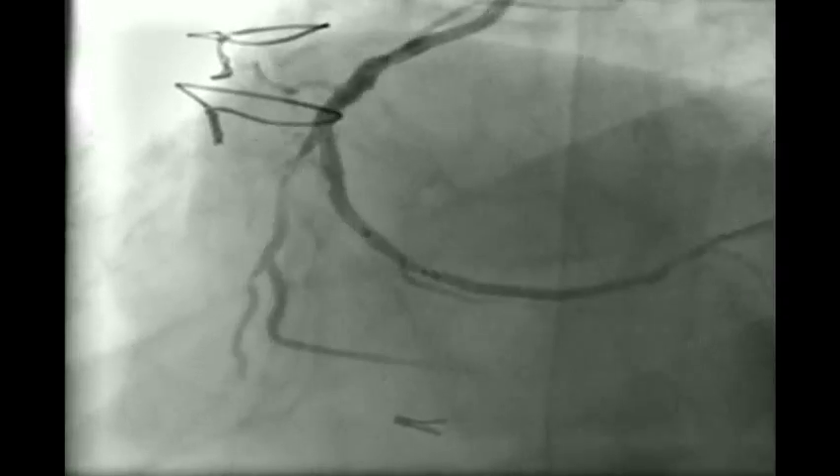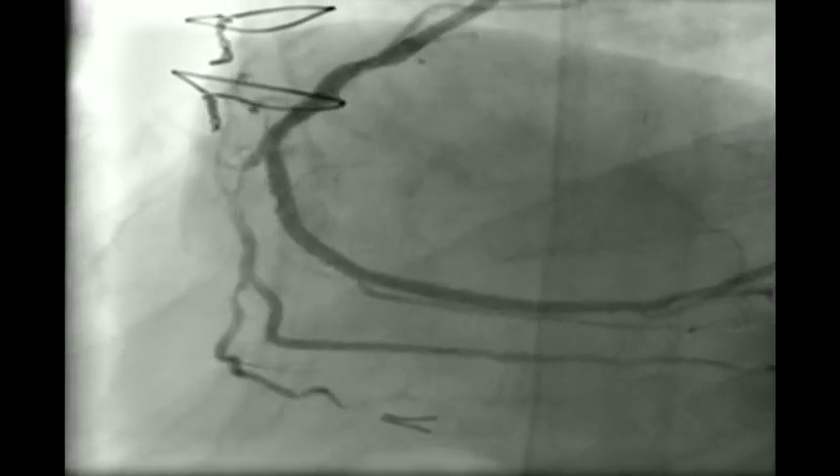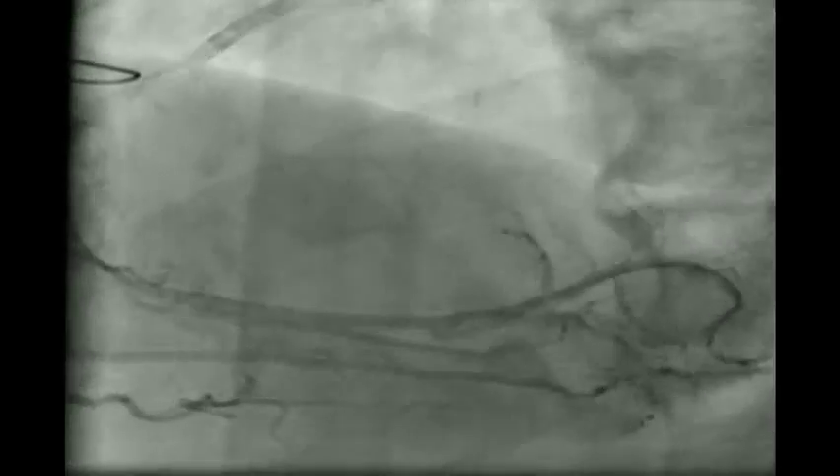We then dilate the distal lesion with the same balloon at around 14 atm and take a check angiogram. As you see, the pressures are now better and the dampening is less. This is the absorb stent — 2.5 x 18 mm, matched 1-to-1. You can see the proximal and distal markers within the balloon markers. It was deployed at 14 atm initially and then up to 16 atm.